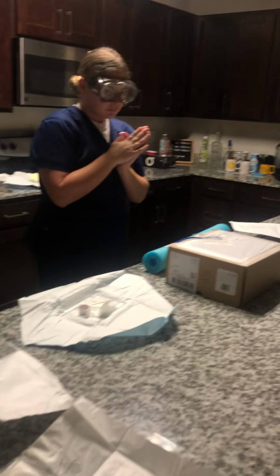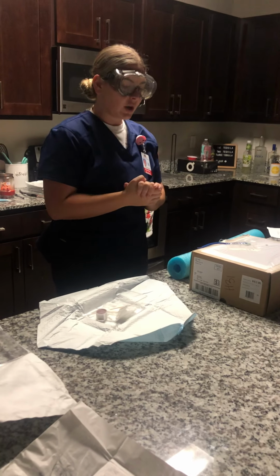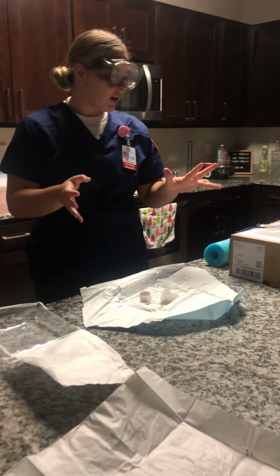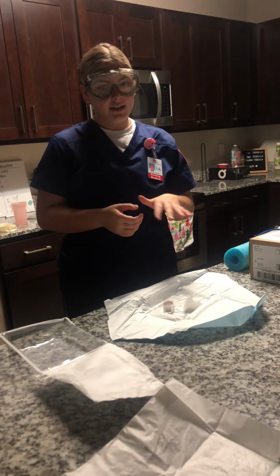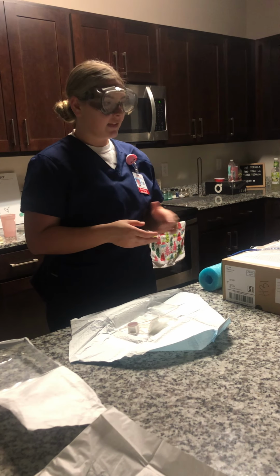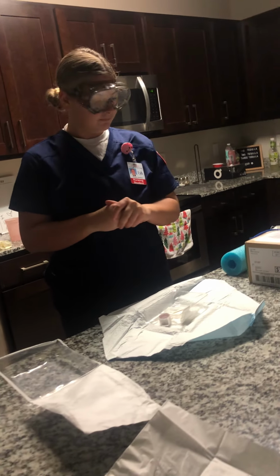And now I can lower the bed, raise the side rail, and make sure that my patient is comfortable. And the call light is within reach, and I do want to document the appearance, the drainage, the type of cleanser that was used, the type of dressing that was used, how my patient tolerated the procedure, and the time, the date, and my signature. That's it, thank you.